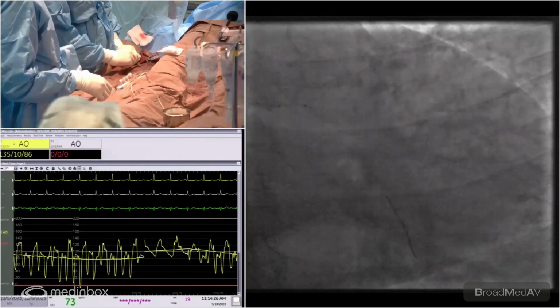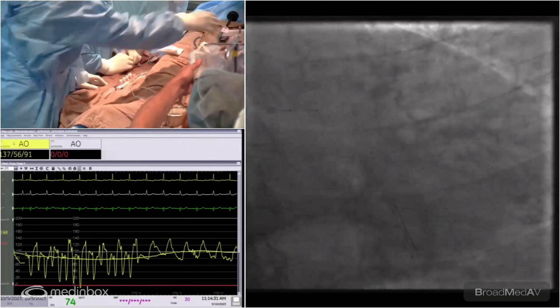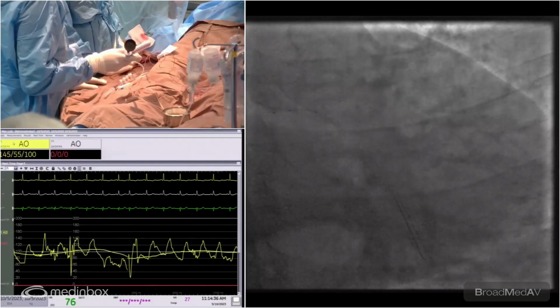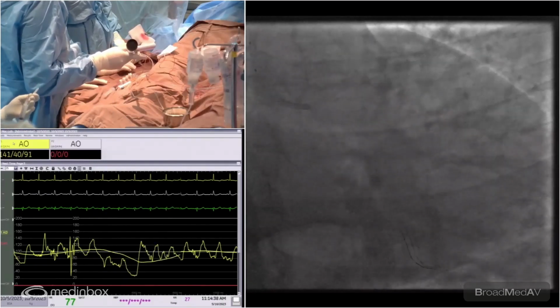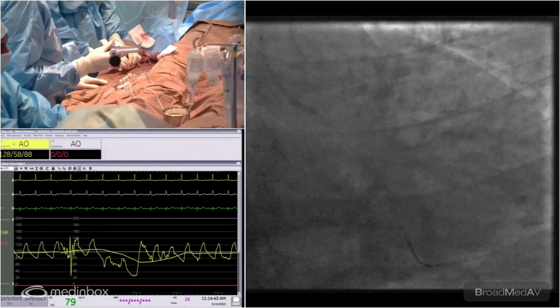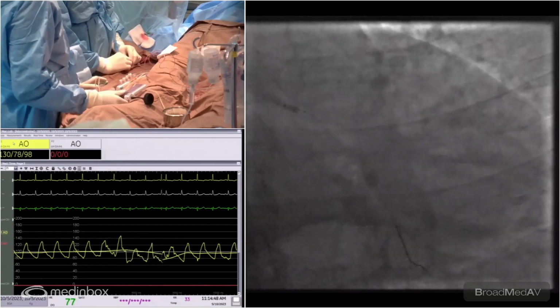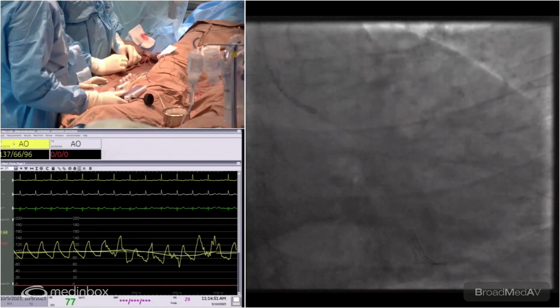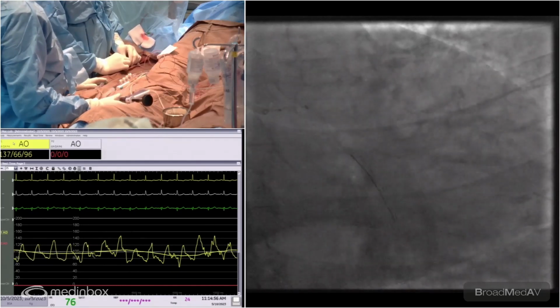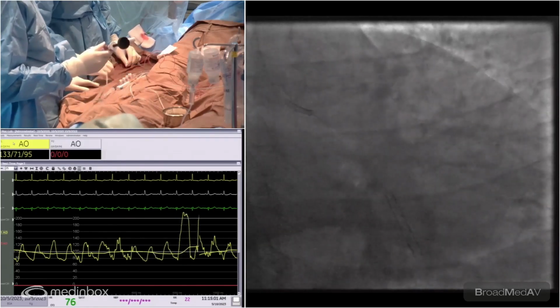So we do a similar plan on the circ. So we got a 2.5 balloon to pre-dilate the circ. We have difficulty going down that bend. So we may have to, and this is the previous balloon. So it's the one we opened in the LAD. Yeah, so maybe it's either due to the strut, which is a possibility, or it could be something else. So what we'll do, Ashish, is that we can simply get a new 2.0 balloon, please. Get a 2.0 balloon, please.